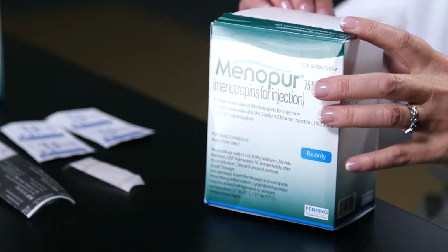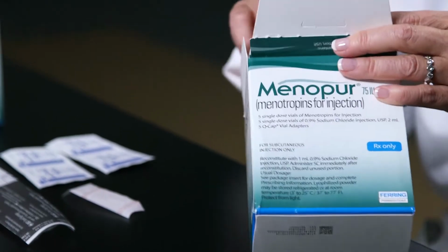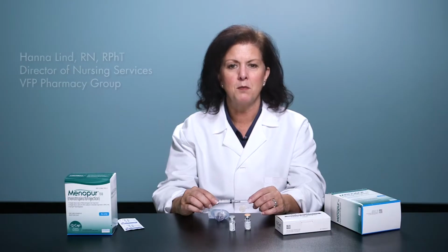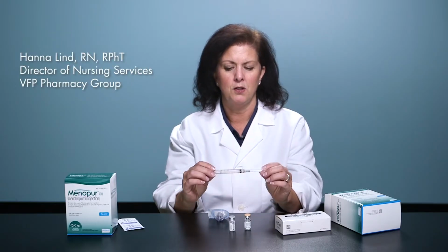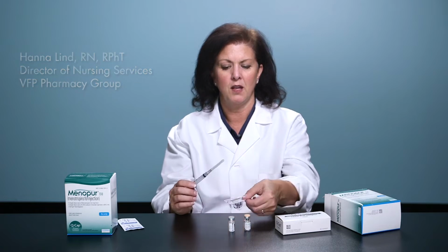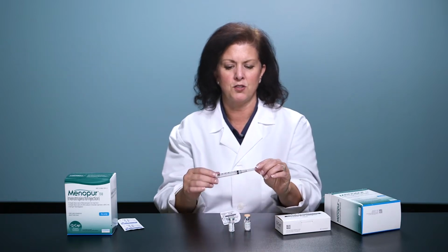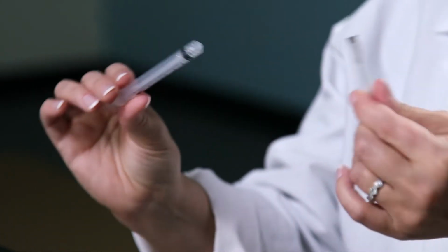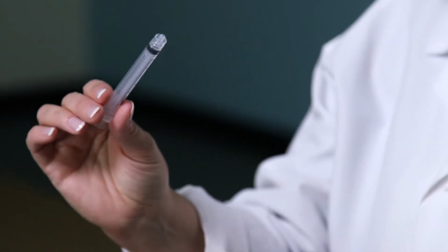Prior to mixing this medication, wash your hands thoroughly with soap and water and make sure you're using a nice clean surface. Mixing the Menopur using a Q-cap, you'll need your vial of medication, sodium chloride diluent, a Q-cap, and your syringe. If your syringe still has a needle attached, twist it off. You won't be using this.